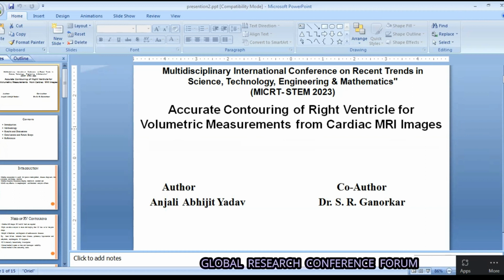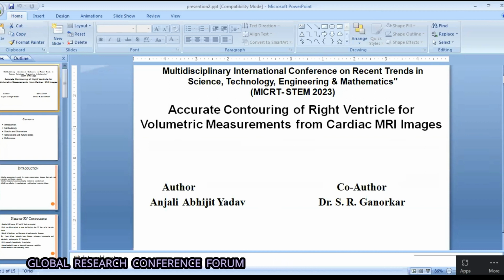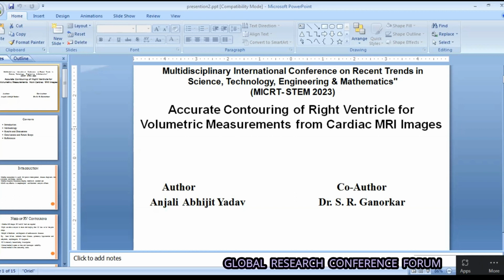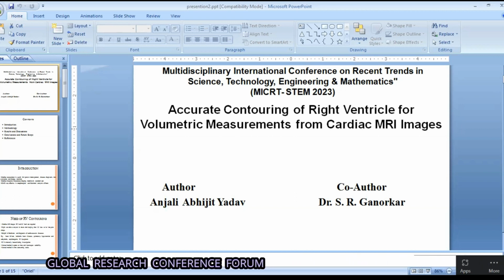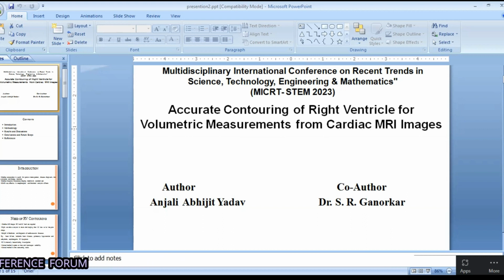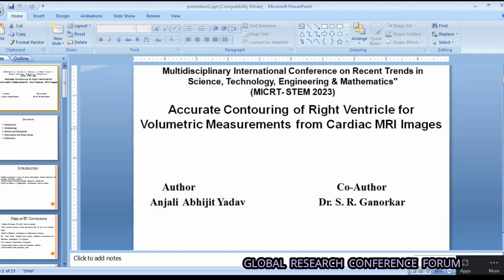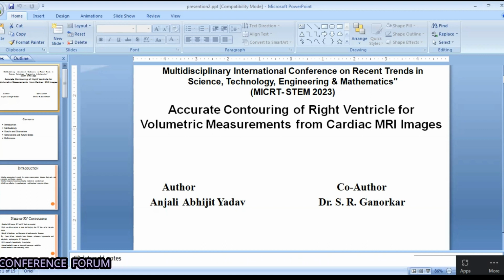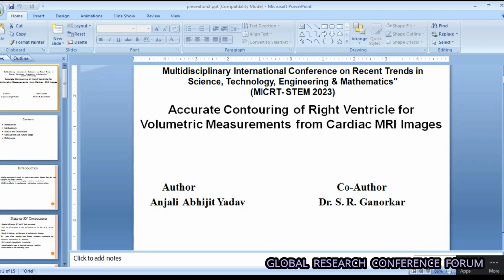The volumes are computed as the sum of all areas multiplied by the value of space between slices. Blood volume is nothing but the sum of all the areas selected as systole phases or diastole phases multiplied by the space between slices, where space between slices is nothing but the absolute difference between slice locations in the DICOM fields of adjacent frames.